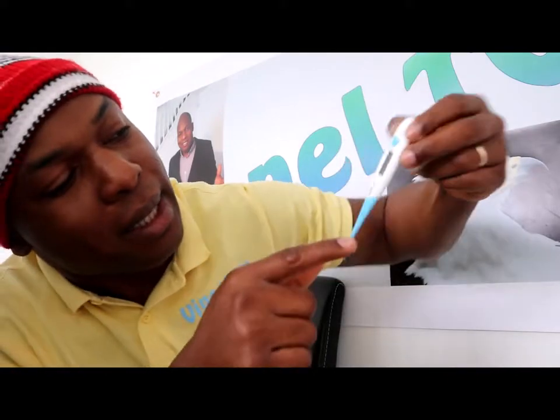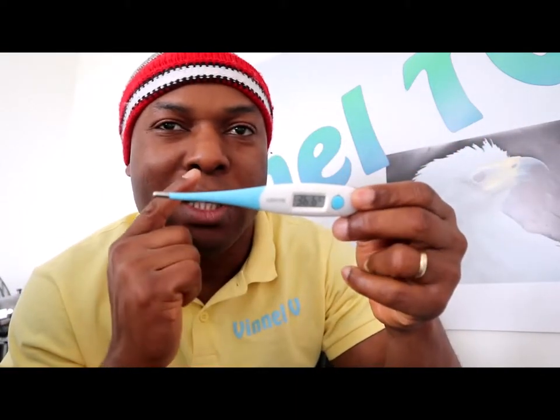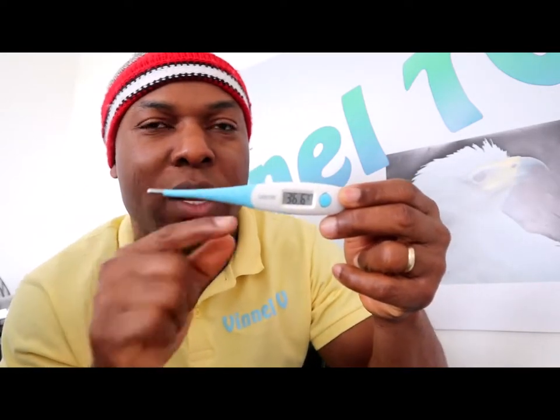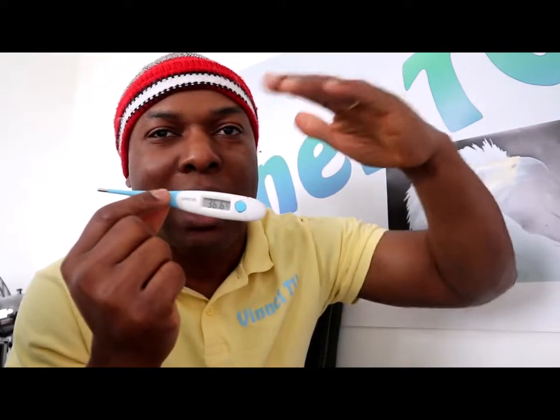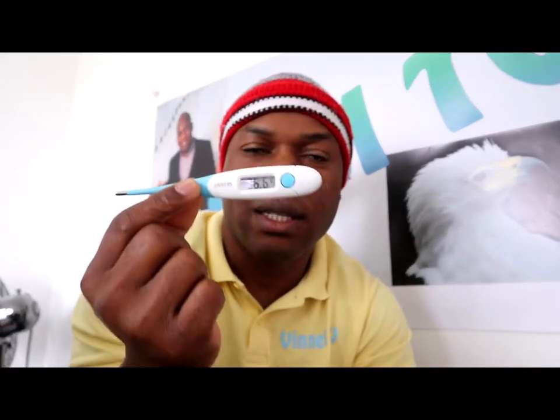Okay, so guys, this is how to check this, 36.6. But if you check this and it's above 37.5 degrees, you know that you've got a fever. Normal body temperature is 37 degrees, but you've got leeway slightly above and under. Once you measure this, you can see I've done this now, it's 36.6, which is my body temperature.